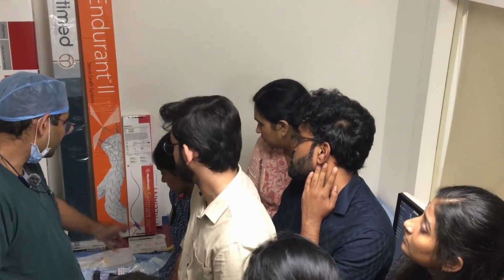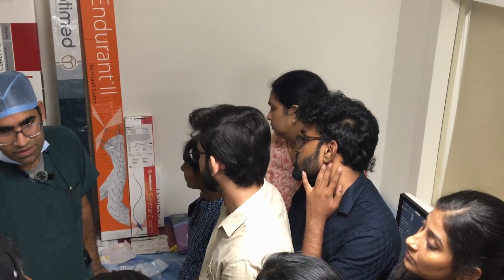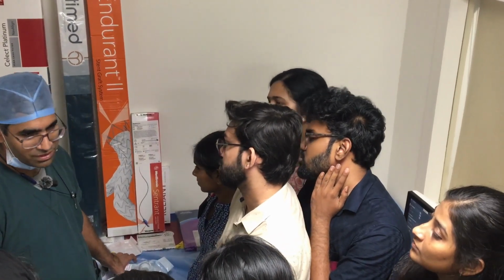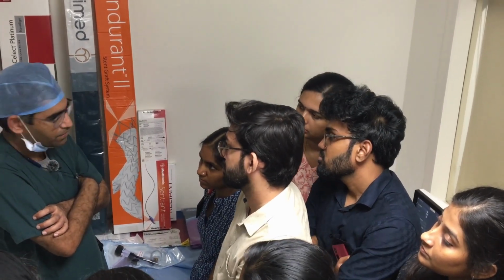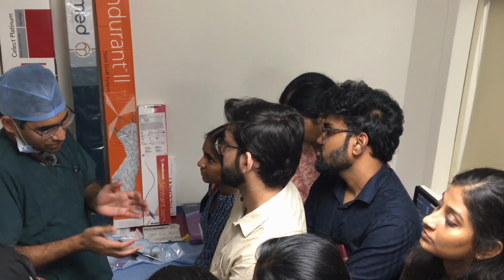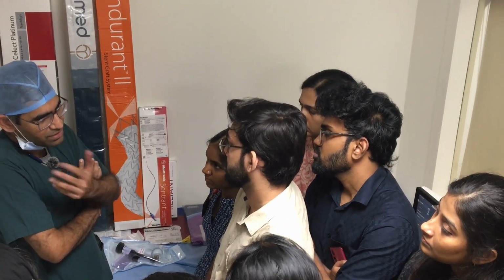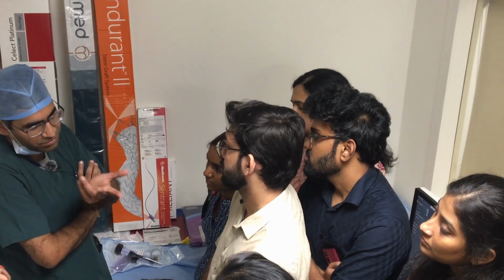Then stents. Stents are broadly two types: self-expanding and balloon expanding. So where do we use self-expanding and where do we use balloon expanding? By design, to put a balloon expandable stent, you have something which can expand the stent. So the stent has assistance in expansion. Self-expanding stents do not have assistance, so they have to expand by themselves.